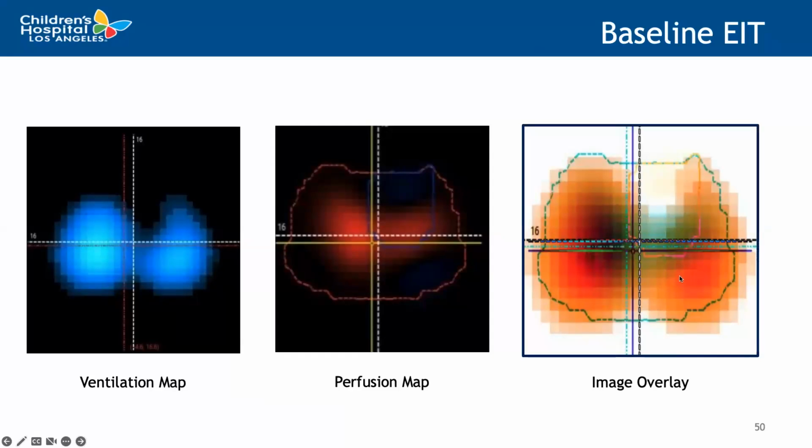What I was curious about was, I knew that the pulmonary hypertension team was planning to initiate therapy with nitric oxide and treprostinil. I wanted to get a sense of what was happening over time, as we don't have other great metrics besides echocardiogram to see how those therapies may be affecting lung perfusion.